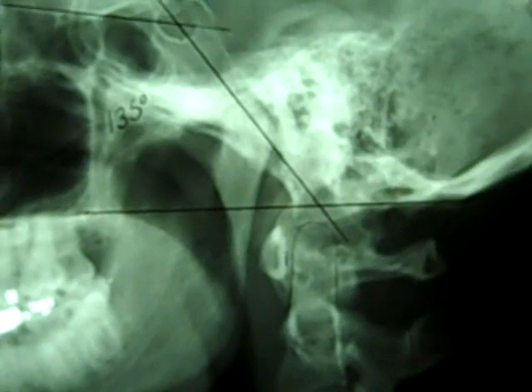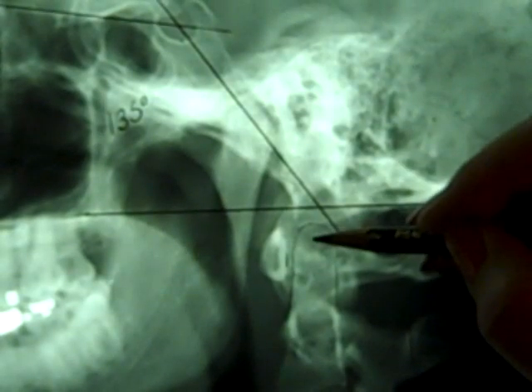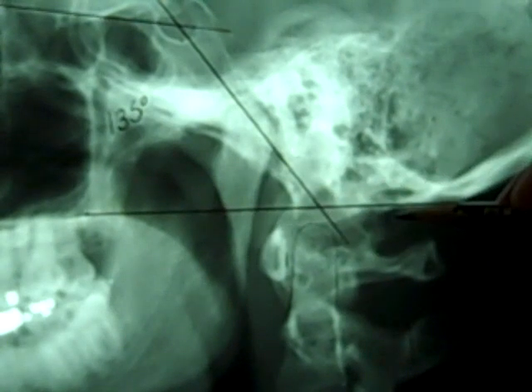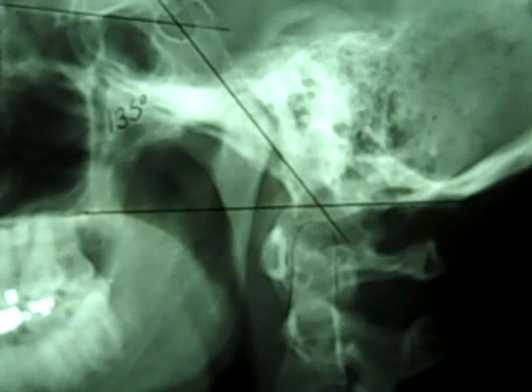So you see that on this particular film, it's not any above the line. So on a paper, I would record this as 0, and I would move on with my life. But what I don't want to see is this above this line, more than 8 for males or more than 10 for females. If it is greater than either of those numbers, you would need to be worried about platybasia and/or basilar impression.